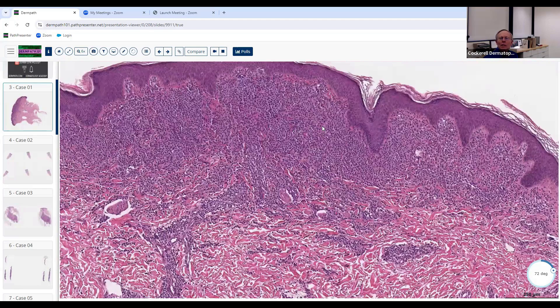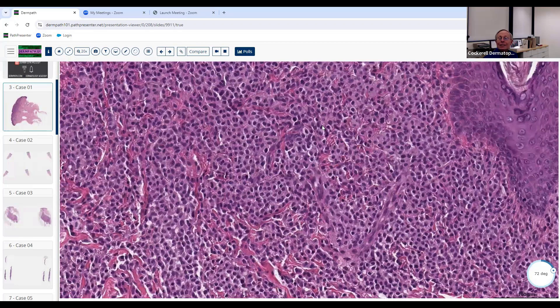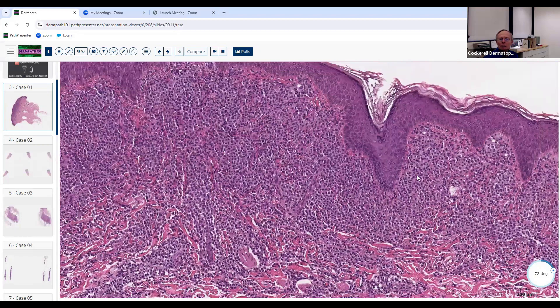As you go to higher magnification, you can see these cells are very monomorphous — one looks pretty much just like another. That's a nice clue to the diagnosis of a form of mast cell disease: mastocytosis, mastocytoma, urticaria pigmentosa. All those diseases are lumped together as part of the same general process. This one has so many cells we'd call it a mastocytoma. These lesions are often seen in infants. If you encounter one clinically, eliciting a Darier sign can cause degranulation of so many mast cells that patients can develop systemic symptoms and shock. We've seen patients die because someone rubbed hard on a mastocytoma.